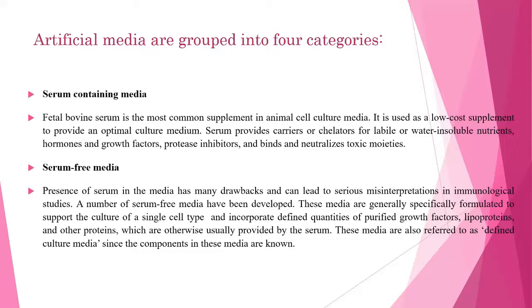Okay, so that's why the cells which are incompatible for all these things will be grown in a serum free media. Okay, so if the cells require a very optimum condition, or if cells which have to be isolated require a better growth medium, that's when the serum free media will be considered. So serum-free media are developed, and the media is generally formulated to support the culture of a single cell type. So as I mentioned, those cells which are not able to become compatible with the environment, with the different types of nutrients added, or the type of cell which we culture also matters for selecting a serum-free media.